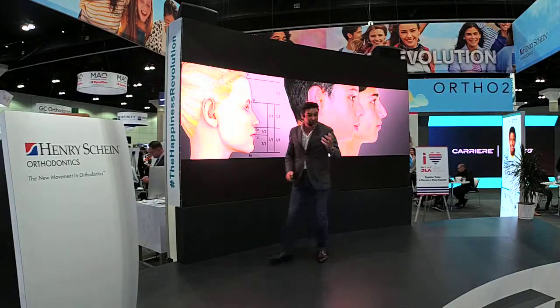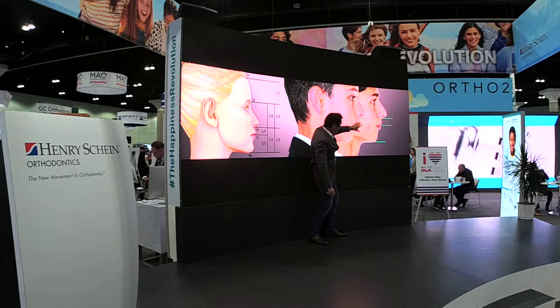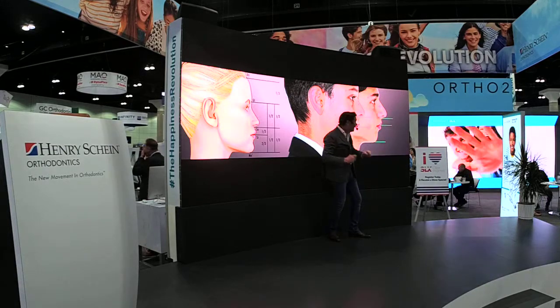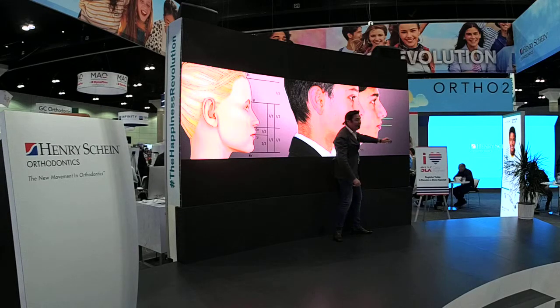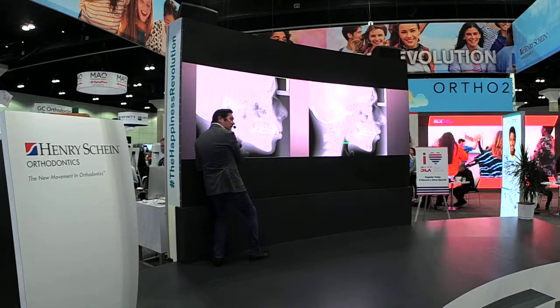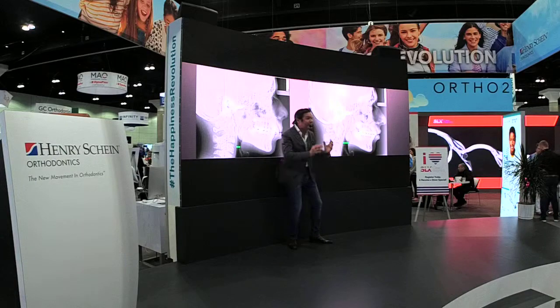If we compare this with the proportions that Leonardo da Vinci was giving us, we will see that at the beginning, this case had an upper lip that was too long, and the two lower thirds were too short. Now, by releasing pressure without extracting teeth on this particular case, we shorten the upper lip and we balance the thirds of the face of the patient. And this is very important, but another thing is that we invited this mandible to go forward, and this airway that was narrow has now been expanded in the area that the orthodontist is able to work.